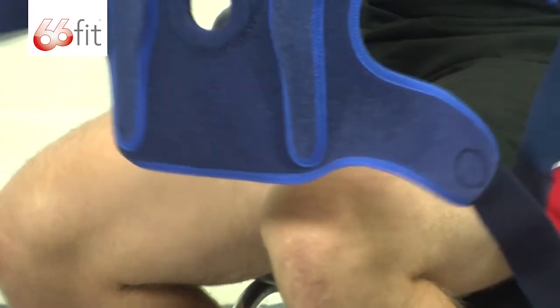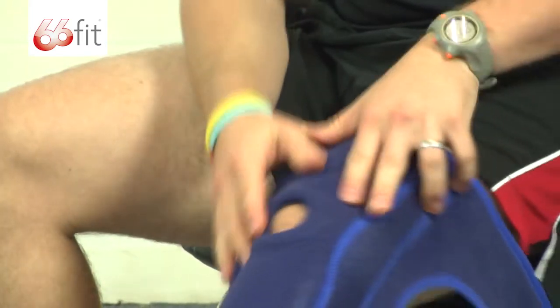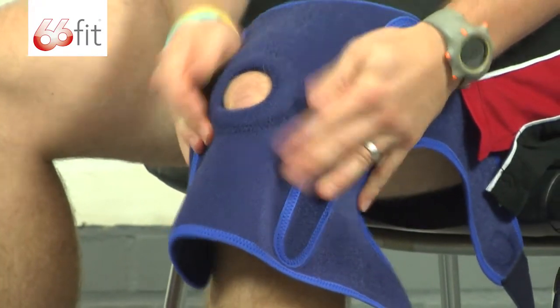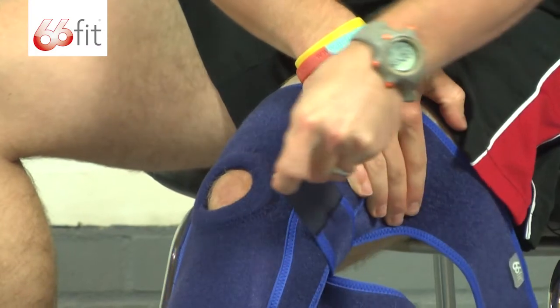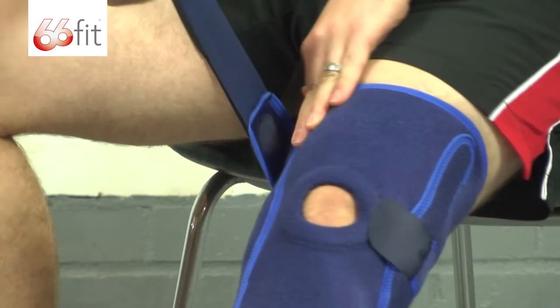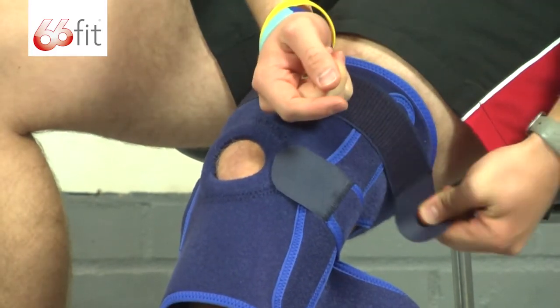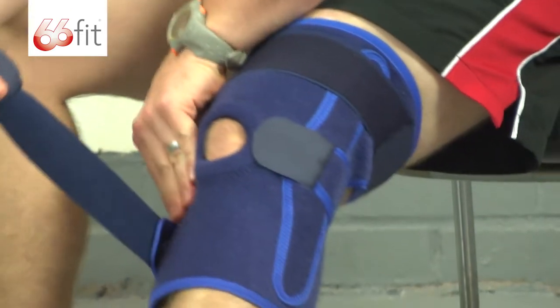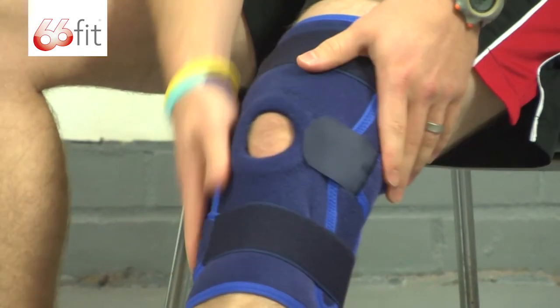It's dead simple to put on, but there is one thing I would say when putting it on. Put your knee in the little opening and make sure that you do up the middle strap first. Then pull the top strap round and secure that in place. Likewise with the bottom — pull that round and stick that one down.